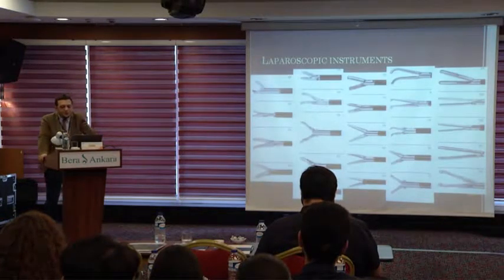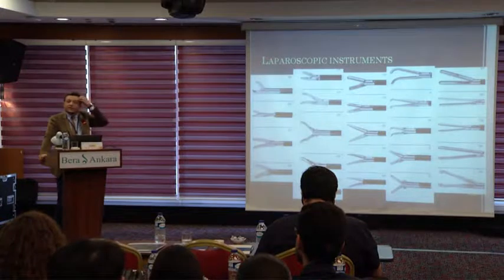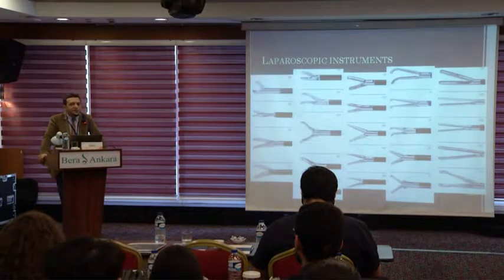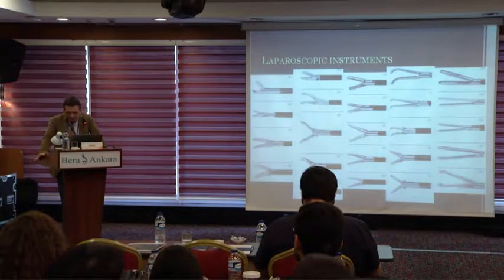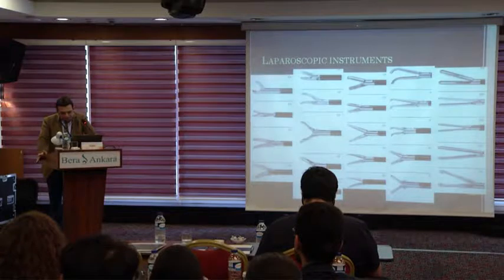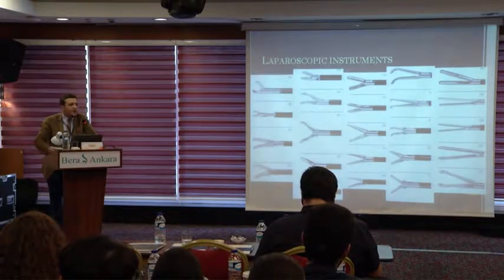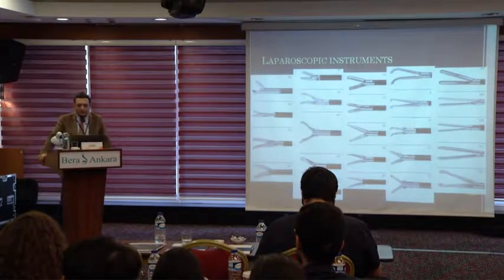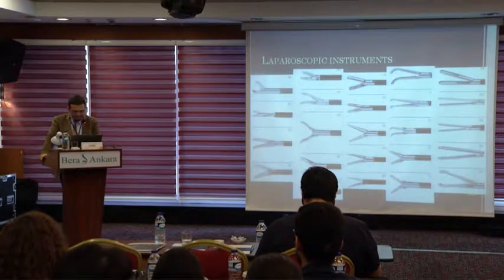For laparoscopic instruments, you can find every single instrument which you use in open surgery in a laparoscopic type. Scissors, graspers, dissectors, dolphin type, duckbill type, right angles, needle holders. They all come in reusable and disposable types. And of course, with experience, surgeons make a list of the devices and instruments which he or she will use, or prepare a box.